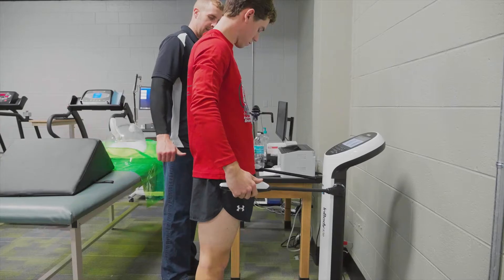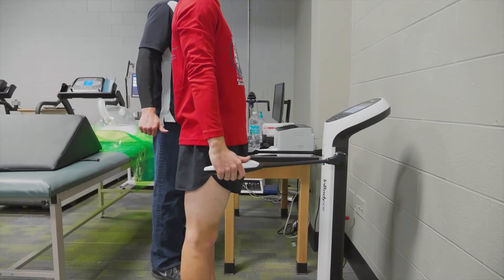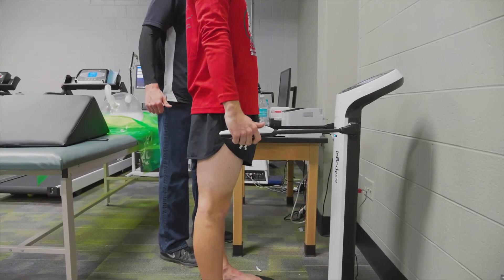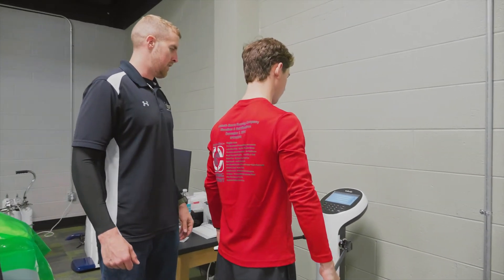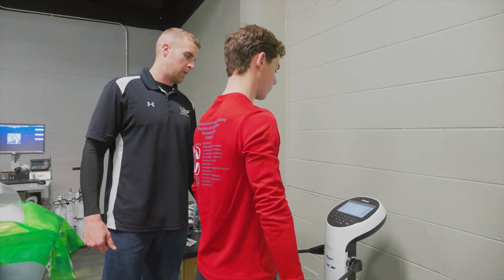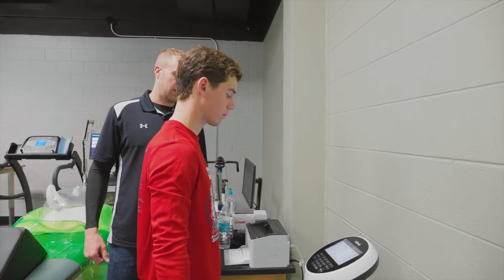We have a machine called an InBody machine, and what that does is it measures how much water you have in your body. The reason that's important is because when we test your body composition we want to know how much muscle you have and how much fat you have, but your body also has a lot of water in it and that water content can change over time. So if we can also measure how much water you have, it gives us a more accurate assessment of your total body composition.